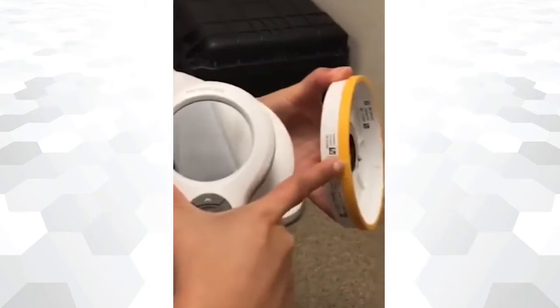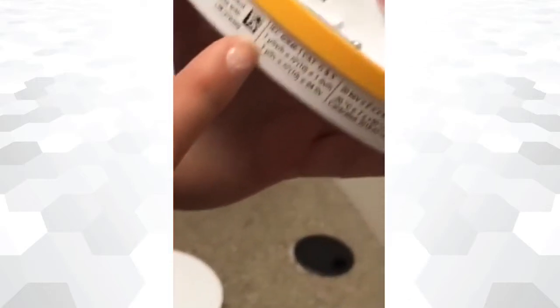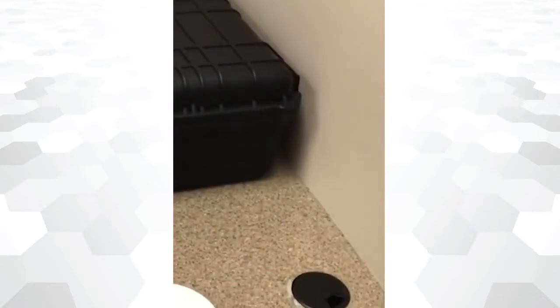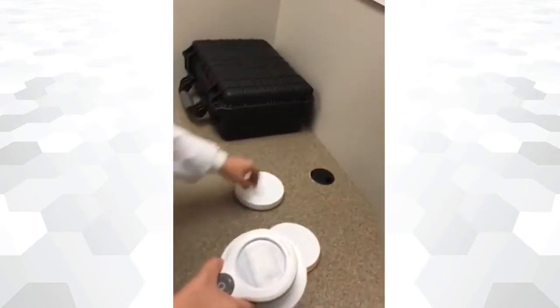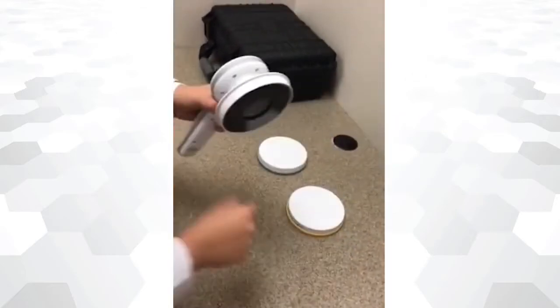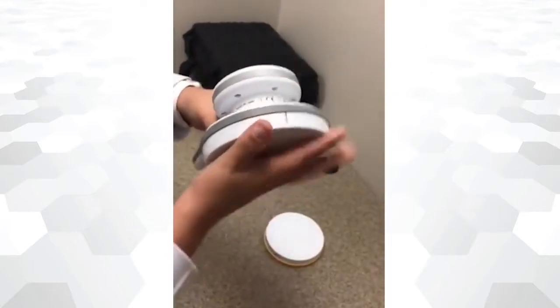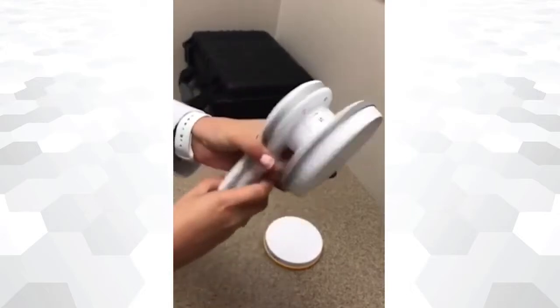The yellow lid identifies the mode for ambient dose equivalent. The label also contains additional information regarding the ranges to perform ambient dose measurements. To place a lid, simply align the black line from the lid with the black line in the detector and twist to lock properly.